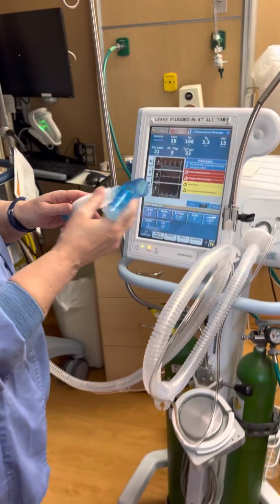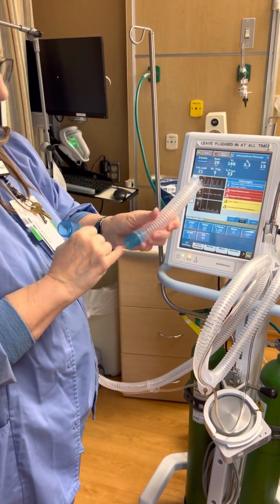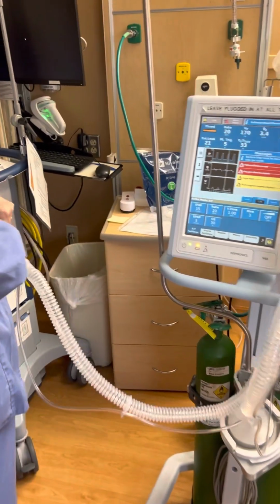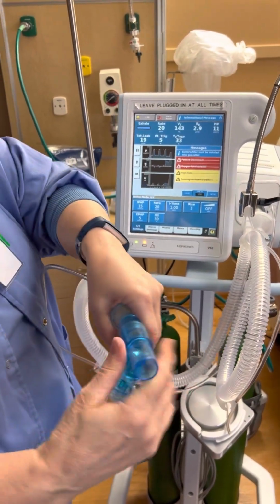Okay, this is for your cannula. You have a T, and you grab another small cup. I'm going to silence it so it doesn't alarm on me while I do this. So now you put that on there.